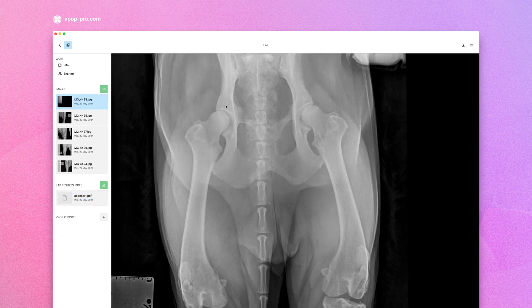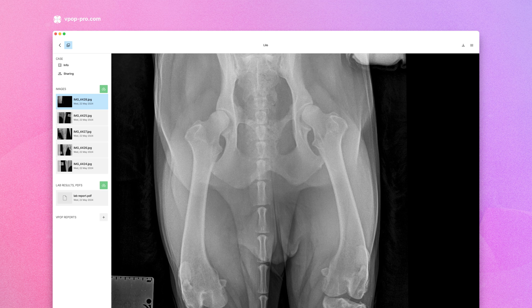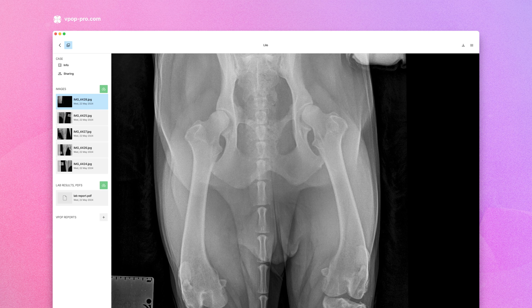Feel free to add radiographs, DICOMs, or any other relevant images. VPOP will automatically complete case info from metadata in DICOM images. Add any relevant PDF files such as lab results and reports.